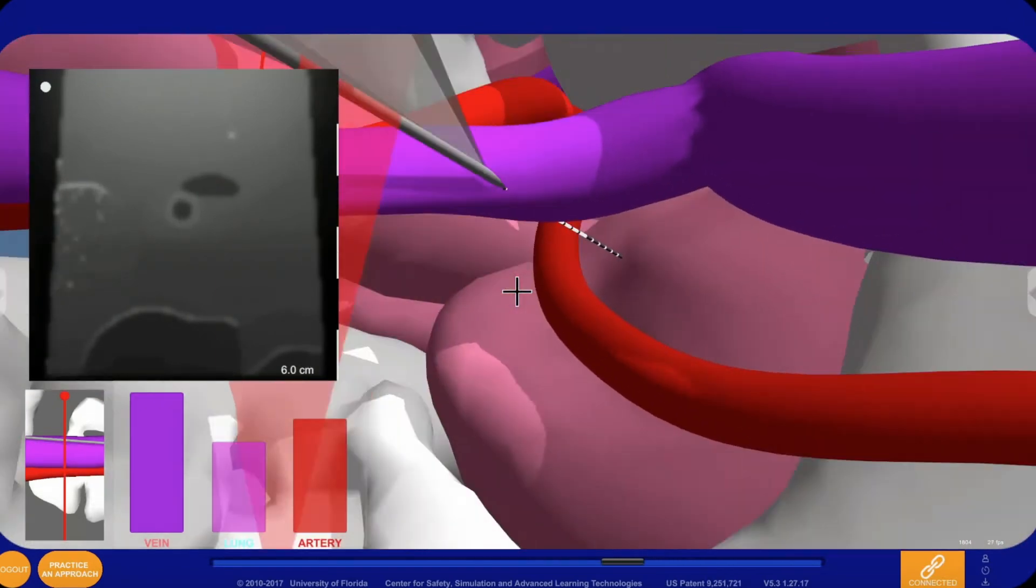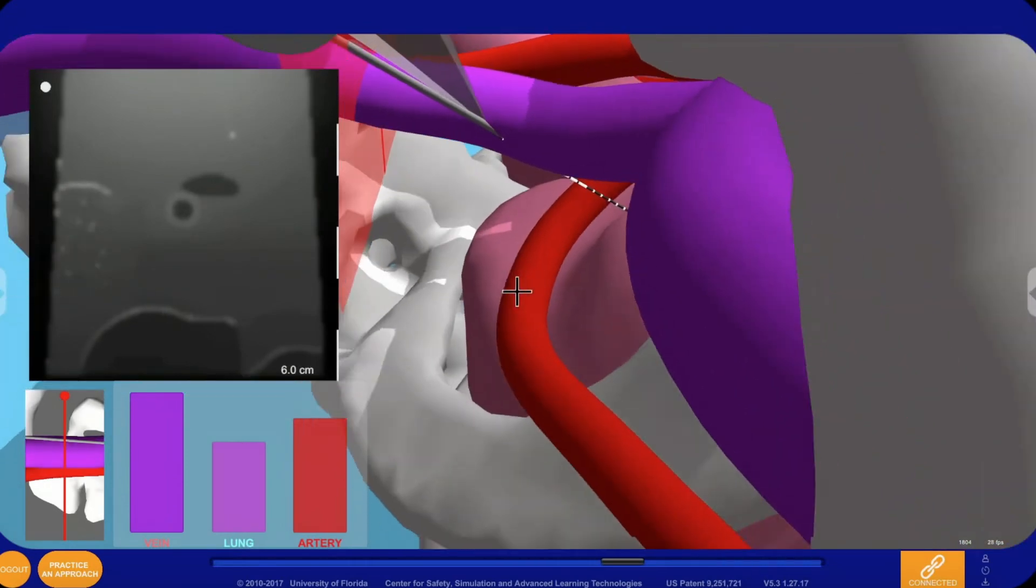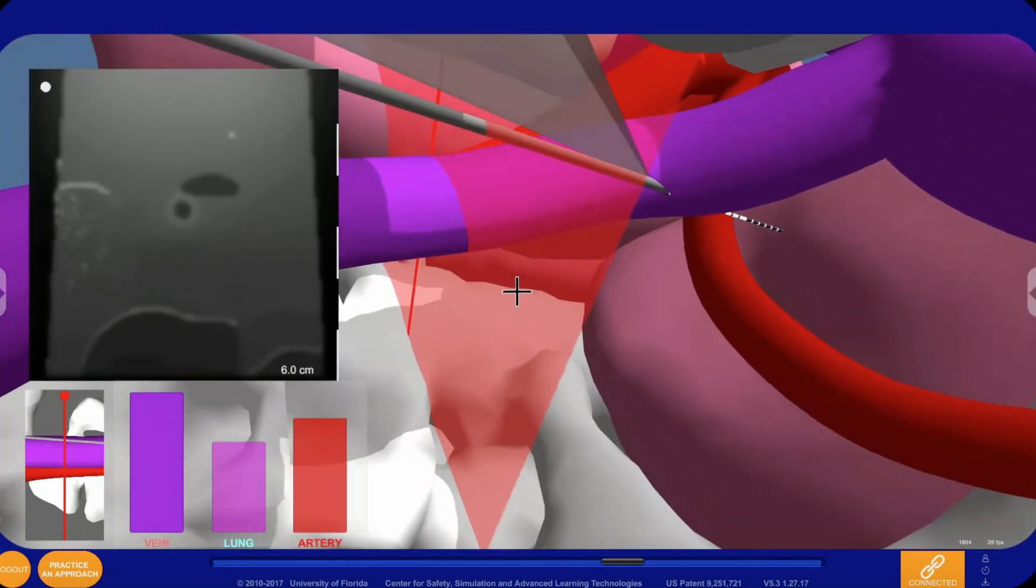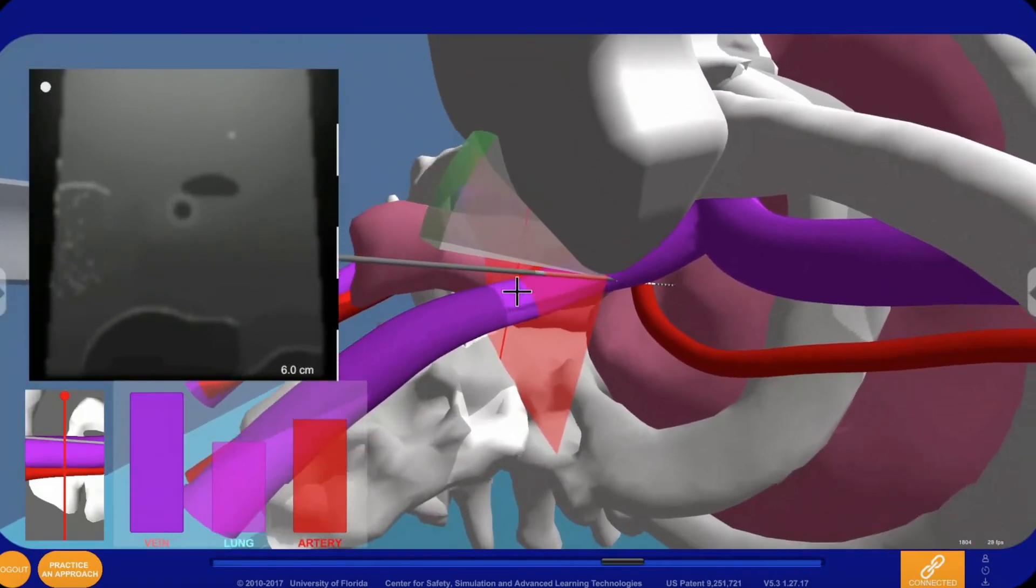When the needle is in plane with the ultrasound, the needle aligns with this red line. This aid is useful for troubleshooting ultrasound probe and needle alignment.